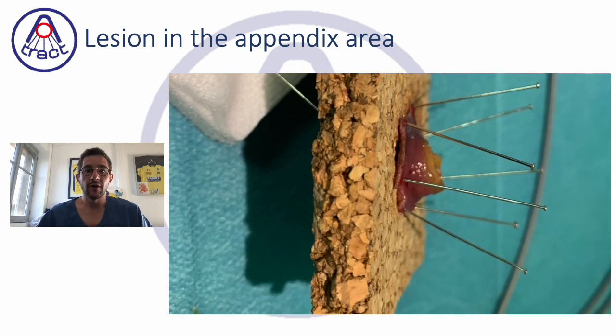So without traction, it seems difficult to have this kind of access. And with this, it is possible to remove the mucosa of the appendix and therefore the lesion which is involving the appendix.